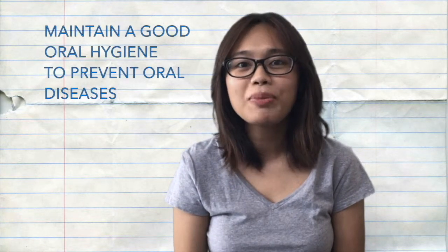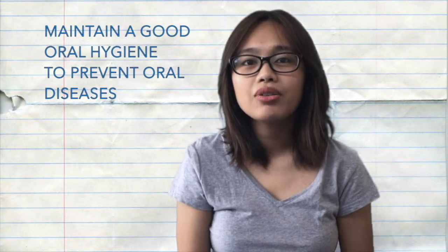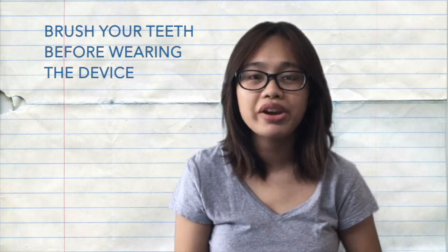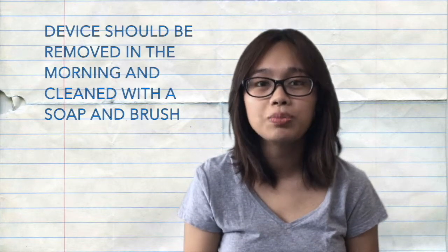In terms of taking care of the appliance, we all know that the device is worn while we sleep, so it makes it even more important to maintain good oral hygiene to prevent oral diseases. Of course, the device should be cleaned before being inserted into the mouth, and you should also brush your teeth before wearing the device. And when you wake up in the morning, the device should be removed and cleaned with a toothbrush and soap or toothpaste.